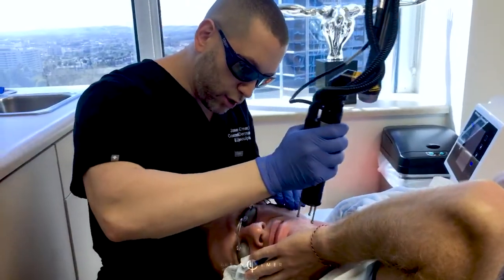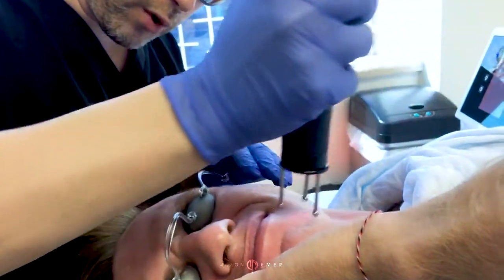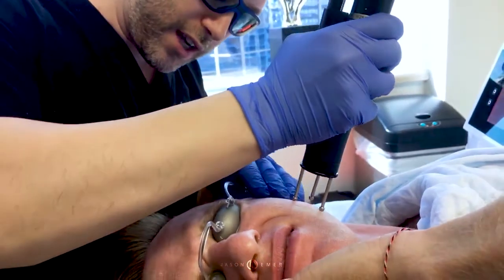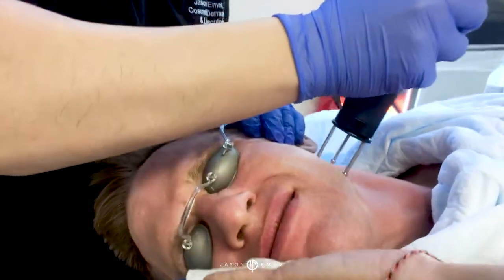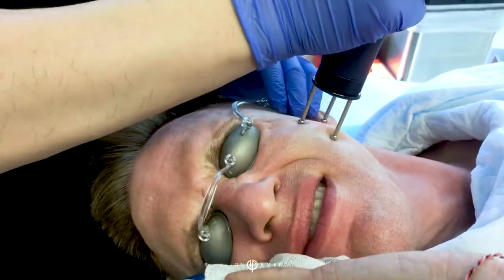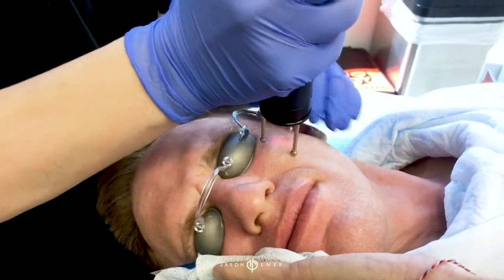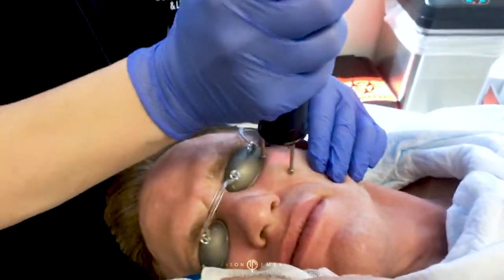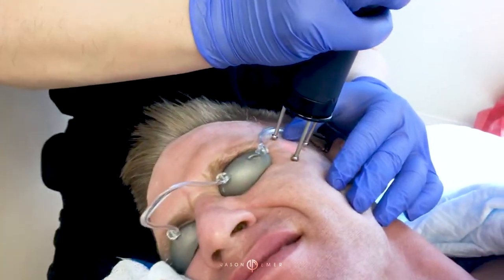We are doing a 2-part procedure today. We're finishing with a little bit more painful spot, but we're almost done. We're using Erbium laser very superficially to help texture and acne scars. We've already done Fraxel, which you can see on my Instagram live if you go there, for just overall rejuvenation, pore reduction, and skin cancer prevention. And now we're using a fractional ablative Erbium to resurface the upper part, almost there, doing really good. And this will also help any scarring, which he previously had.